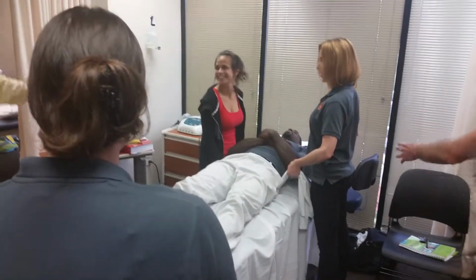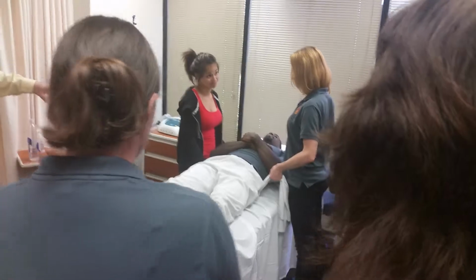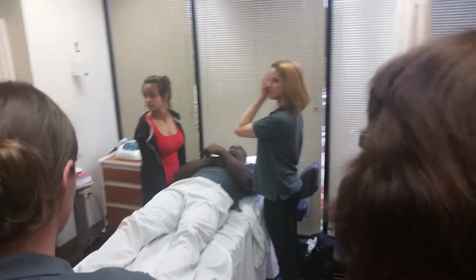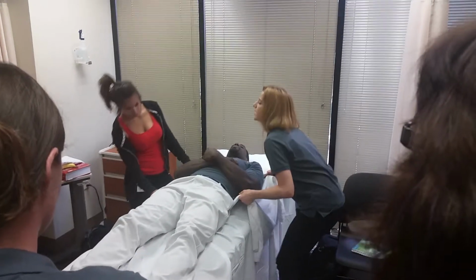How's the table feel for you guys? You need to go to her level. I thought it was too high. Yeah, I think you should lower it. She's not going to be able to help you. Maybe go down a little bit with your left foot. That's good right there.